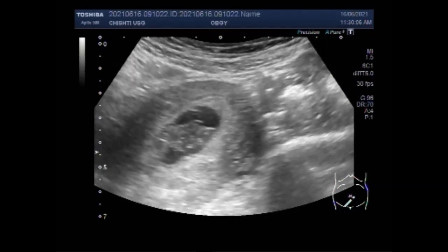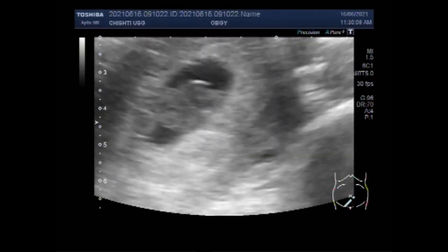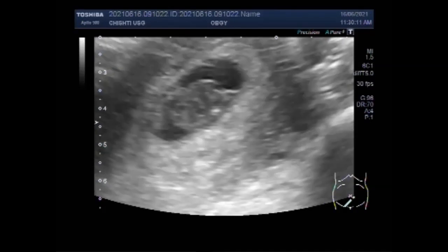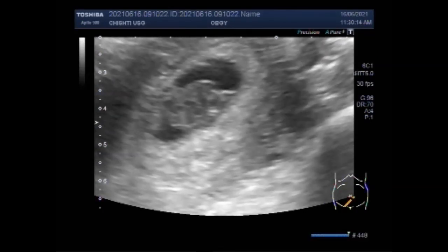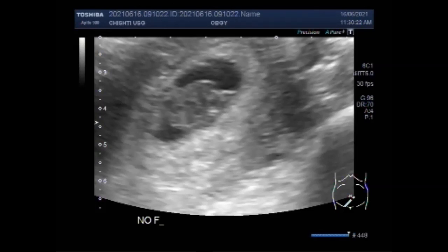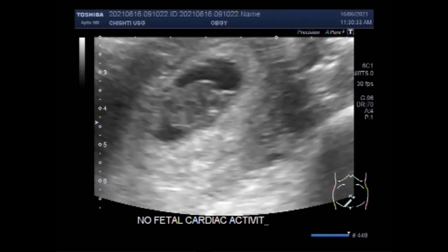You can see the fetal cardiac activity is missing and the fetal blood flow is also not seen. Most practitioners wait until at least 6 weeks to perform the first ultrasound. A gestational sac can be seen as early as 4 and a half weeks after the last period. A heartbeat can be detected as early as 5 to 6 weeks, though it might not be detected that early in all cases.